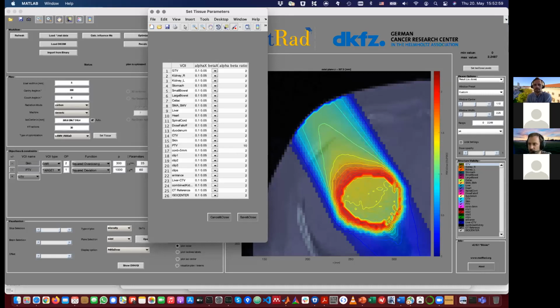So if you have a super slow computer and you manage to do task one, that's also okay. I don't want you to sit until 3 in the morning, or given the time difference, some other time, to finish everything. It shouldn't be an exercise that you have to exactly fulfill and create the best results. It should give you an idea about how it feels to work with this.